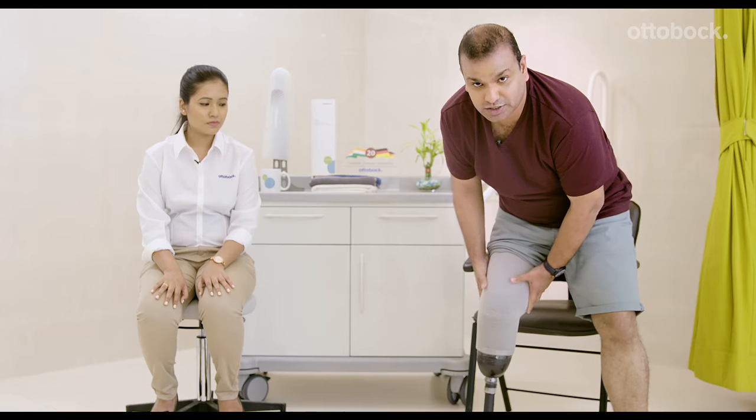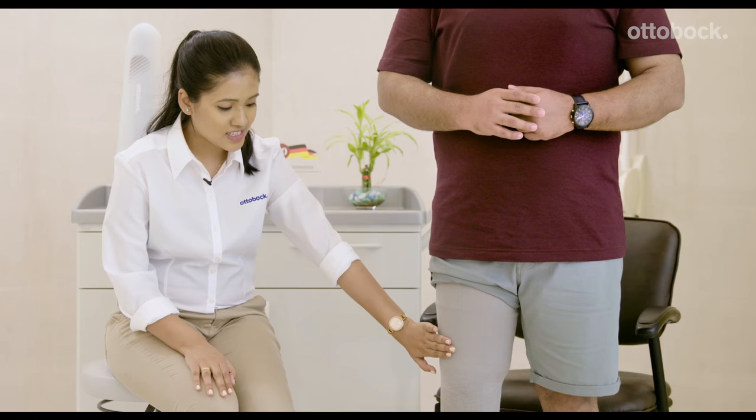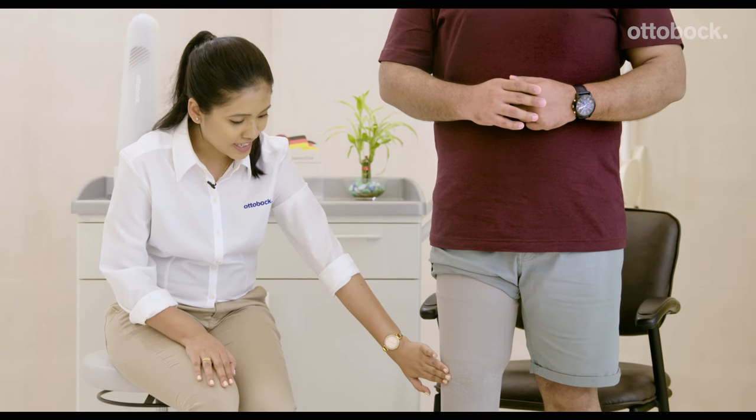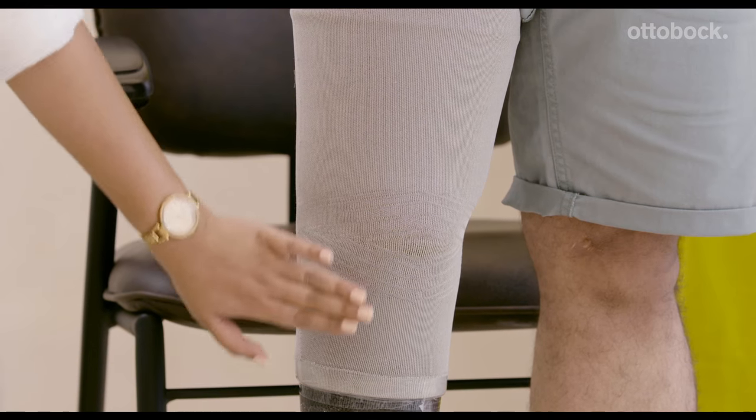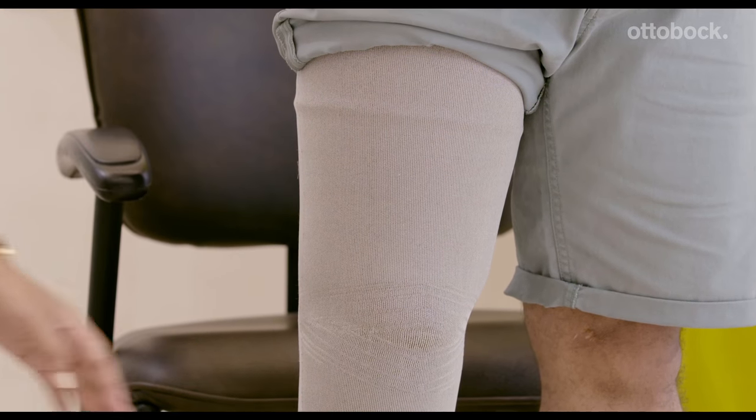Securing your prosthesis to your limb. You have now worn your below-knee prosthesis. Make sure that the sleeve extends 5 cm from both ends — that is 5 cm below the socket and 5 cm above the liner, measured from the back side of the socket.